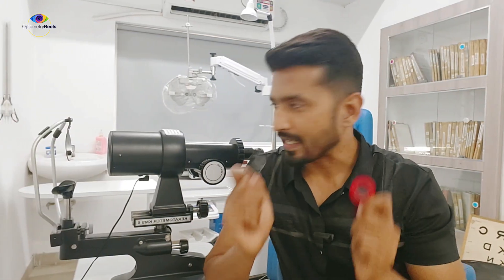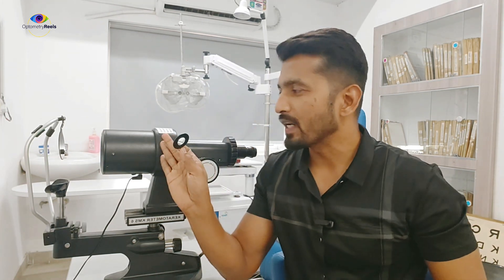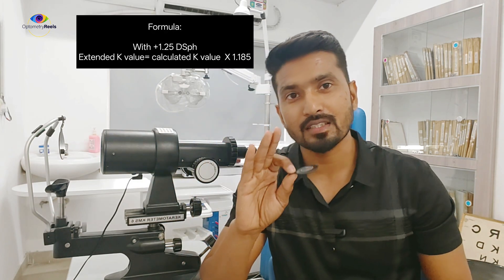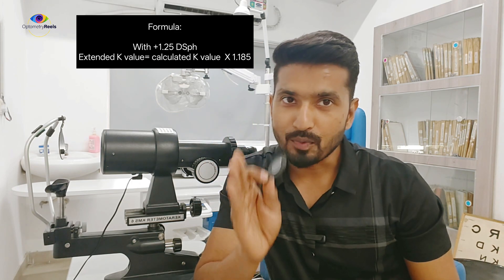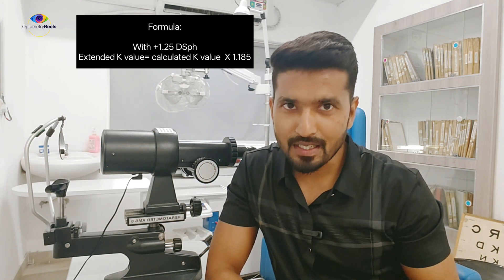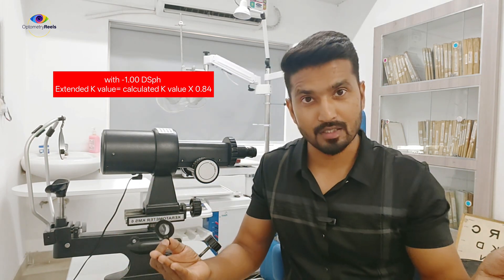After extending the keratometry, we need to perform some calculations, which are very simple. Whatever value you get after placing the +1.25 diopter lens in front of the objective lens, you multiply that value by 1.185, and the result will be the extended keratometric value. Similarly, if you are using the -1 diopter adapter, you multiply the reading by 0.84, and that result will be the extended keratometric value.